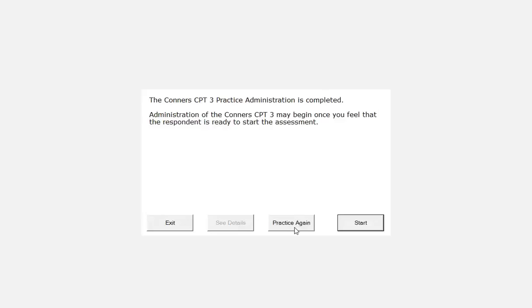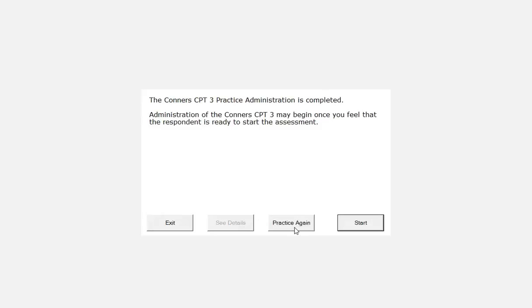In cases where the respondent is disengaged from the task, a one warning approach is used. It is suggested that when the respondent disengages, you make one effort to reorient them by saying a verbal prompt such as, remember, you have to try paying attention the entire time. If the respondent continues to disengage from the task, no further prompts should be given and the program can be terminated by pressing CTRL-Q-Q simultaneously on the keyboard.